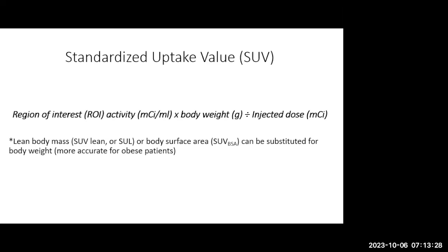I mentioned briefly at the beginning that we have the capacity to quantify the activity, and that is done by using the so-called SUV, standardized uptake value. I just want to show you how it's done, of course, just for your general purpose. It's basically how much activity there is in a particular area that shows increased uptake. And this is the formula. I'm not going to dive too much into it. It's just for your own knowledge. So it's the way of quantifying.